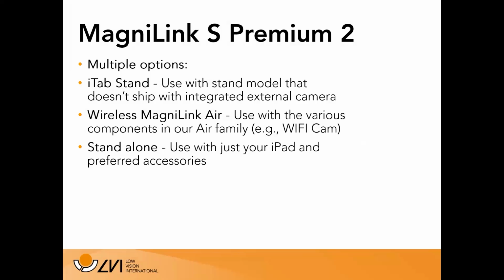As with the Magnilink iTab product and the multiple options there, you have multiple options with the Magnilink S and using iPads. The first one might be to use the Magnilink S with that iTab stand. So instead of the iTab stands shipping with that integrated external camera, some people just get the standalone stand and use it with the Magnilink S. And we'll talk again in a minute about why that might be a logical choice.